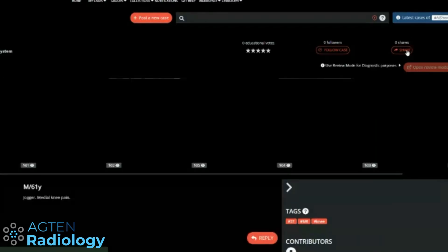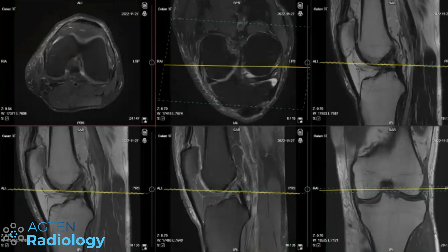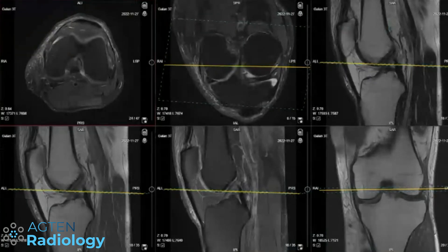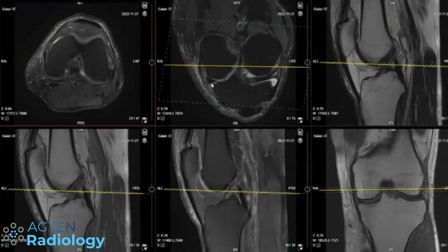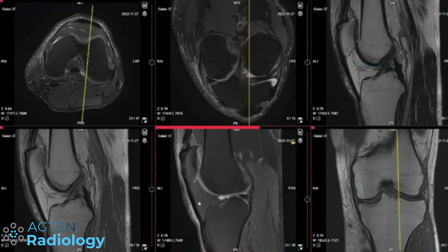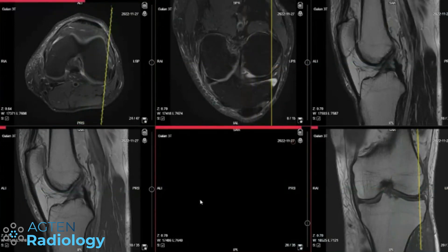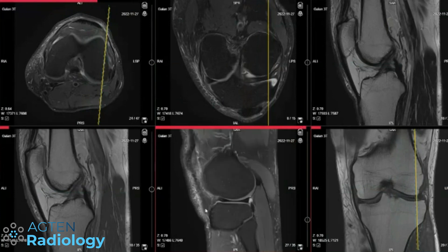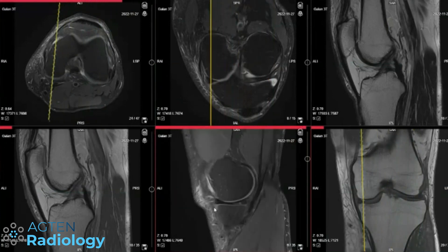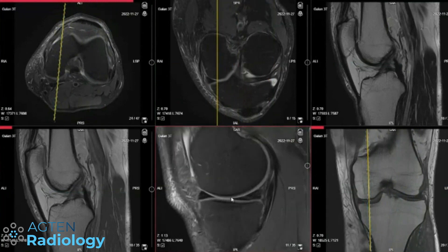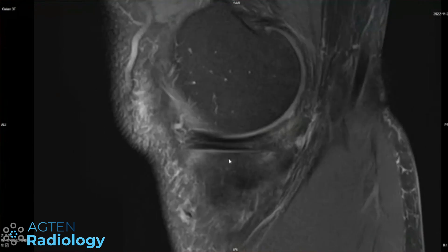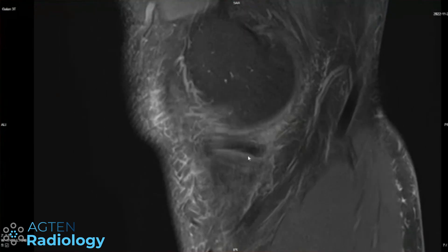So that one is very simple — it's just a meniscus tear, but the morphology is a little different than what I'm used to seeing. It's like a radial tear, but at the same time there's a little flap of meniscus going from under and it's like flipped.